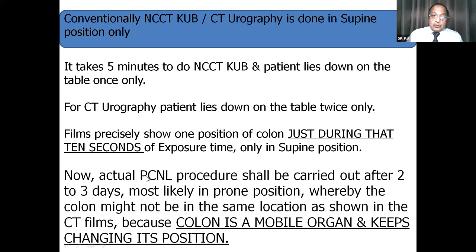But when you are going to do PCNL, maybe after 2 to 3 days, most likely in prone position, these CTs have been obtained in supine position. After 2 to 3 days, you are not sure that the colon will remain there or not, because the colon is a mobile organ and keeps changing its position. So you had taken only 2 exposures of where the colon was, in those 10 seconds each. That's all the information you have.